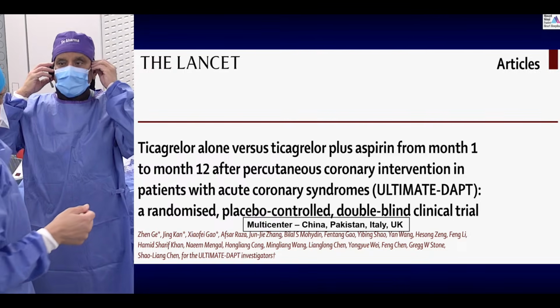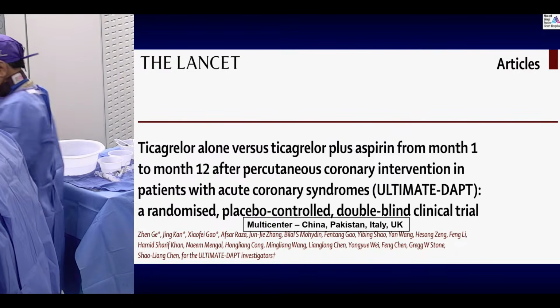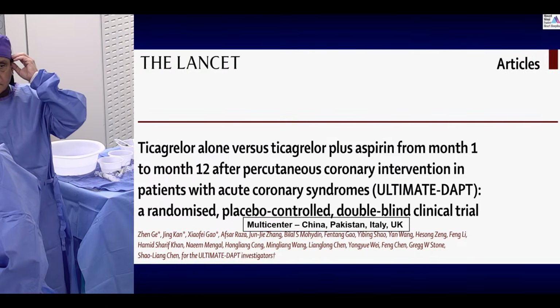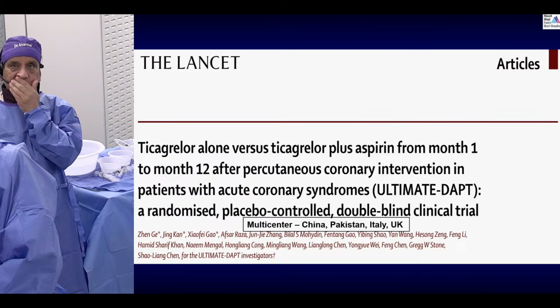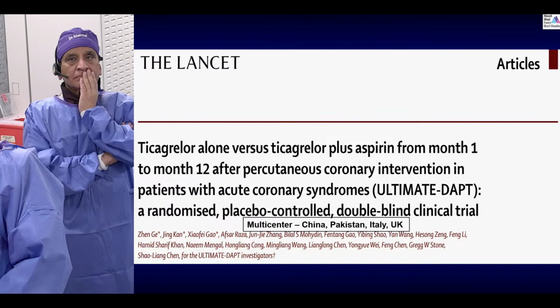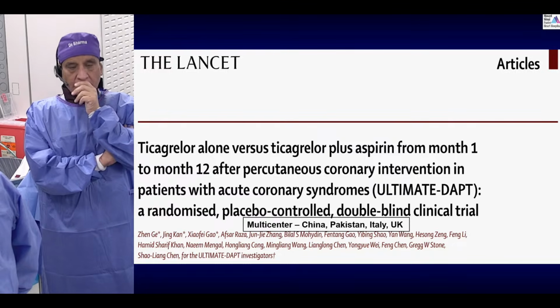I was wondering. Okay. No, my comment was with regards to the vascular closure. In the PROTECT trial, there are very clear guidelines on how to do the vascular closure when patients are randomized to Impella, meaning ultrasound-guided access with pre-close. And if you're not able to get the pre-close, you will have to have an access from the other side to do maybe up and over and closure with the balloon. So we are not sure if that kind of strict criteria was used here.